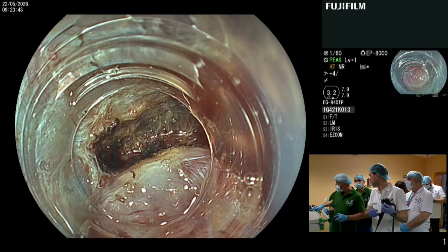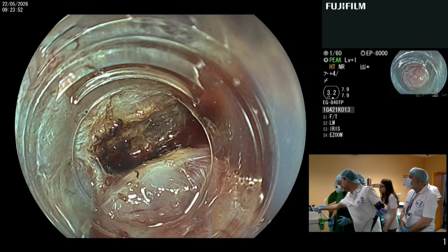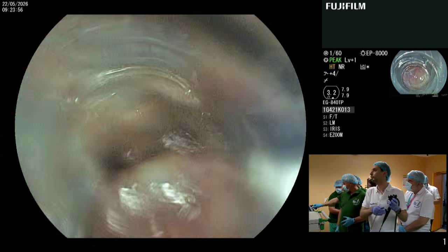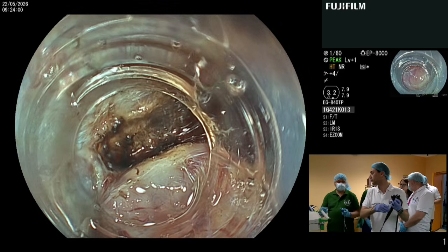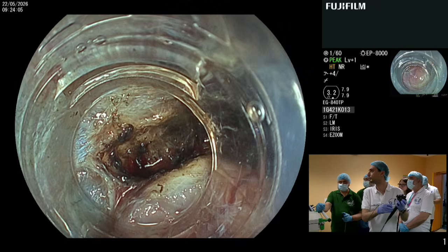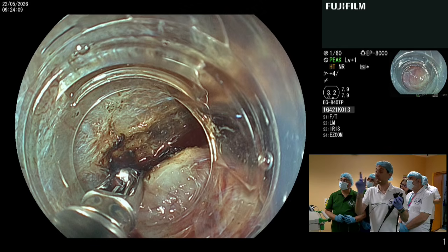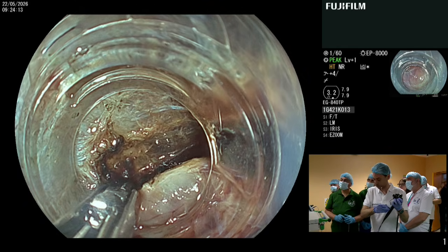Yes? Everything? Yes. Please, hemostasia. Yes. Press this. Okay. So open, grasp. Now I have to pull back. I pull back, and I'm very careful.